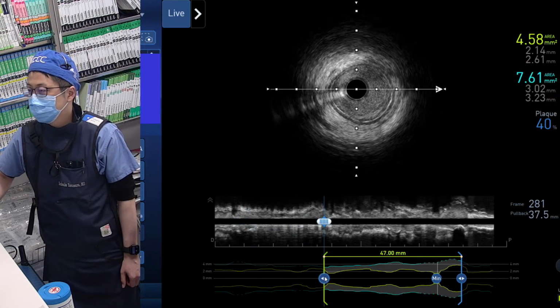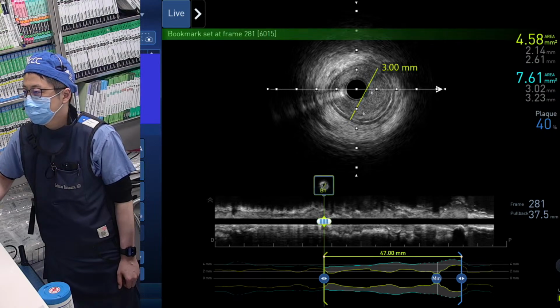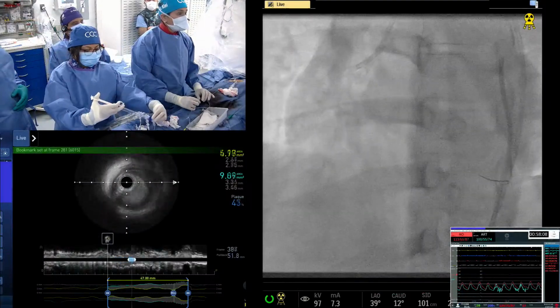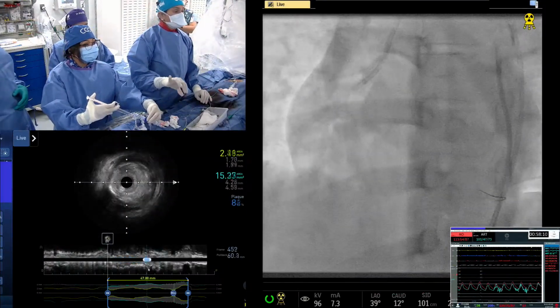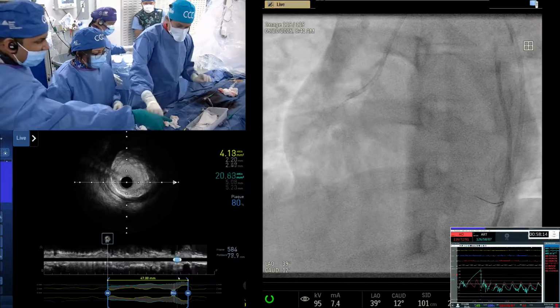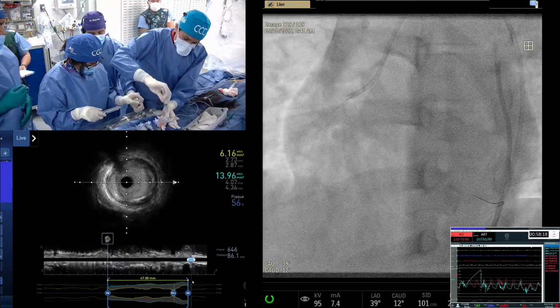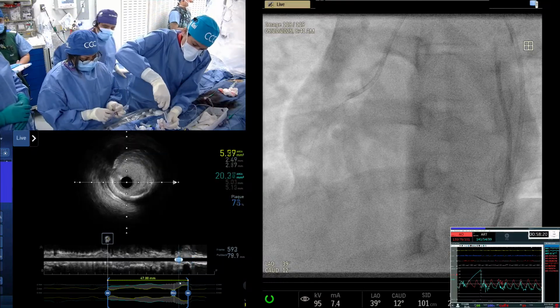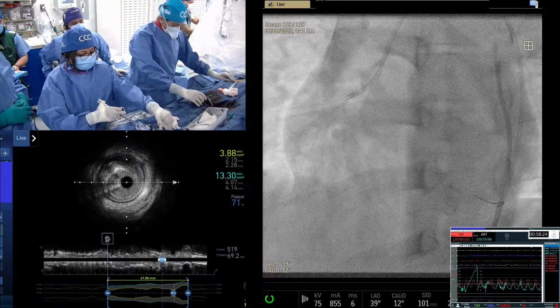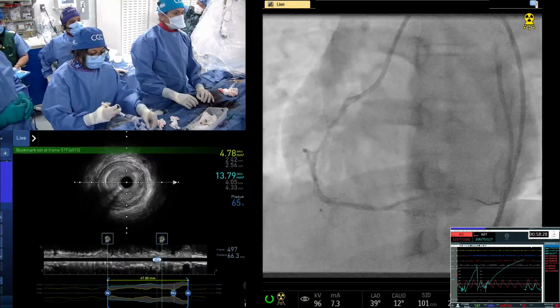That's it. Then if you need something distally, you want to give some more nitro and take a picture. That's a big vessel. Start with 3.0. Give little vasodilators, you have to do. Rehabilitate the vessel. Always before deciding about the stent, make sure you have given a little nitro. The vessel has gotten better.